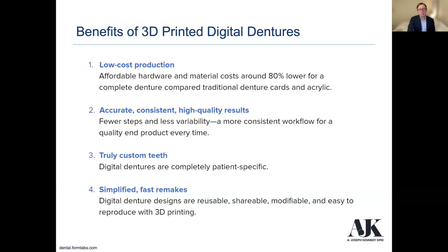And then the nicest part is when you have a digital denture, there's no more "my dog ate my denture," or "I left my denture on a tray and I threw it in the garbage and I totally forgot about it," or "I left it in a hotel room on a cruise." You've heard it all, I'm sure. But the fast remakes aspect of this is really quite incredible. Once you get things digitally designed, you can just go ahead and print another one or mill another one. And that's a really nice aspect.